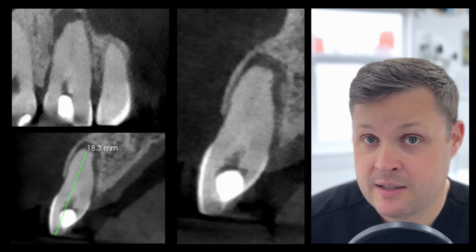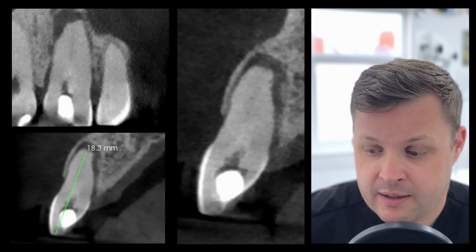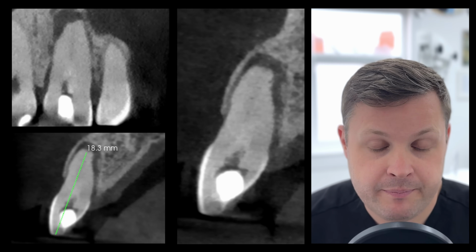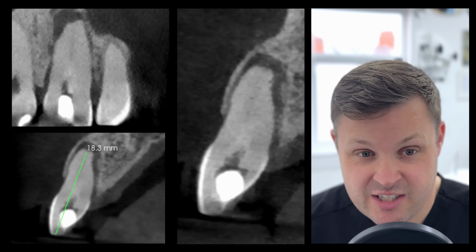That's in contrast to the periapical radiographs, where they're not so accurate, and you can have problems with the orientation of the X-ray holder that can elongate things. So measuring on periapical radiographs isn't great.